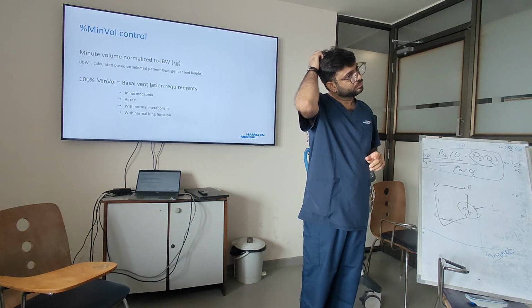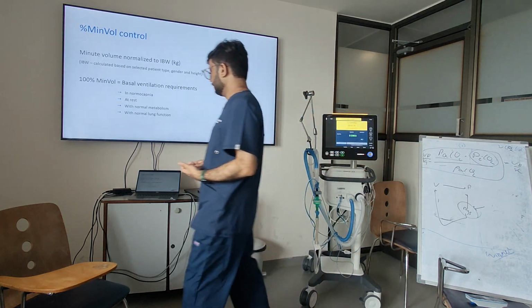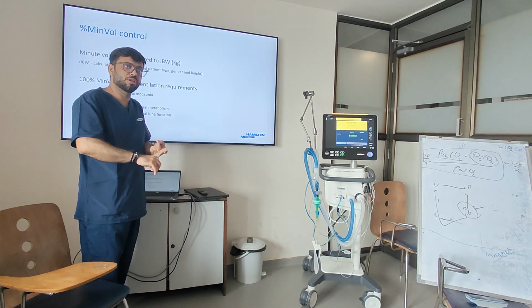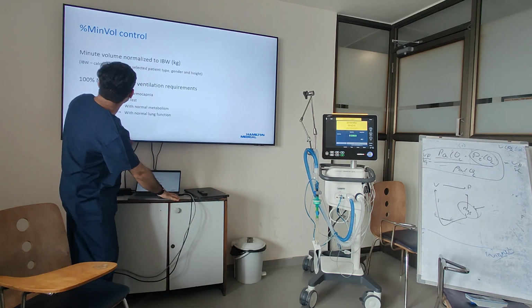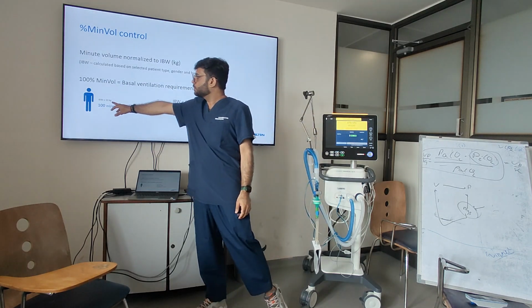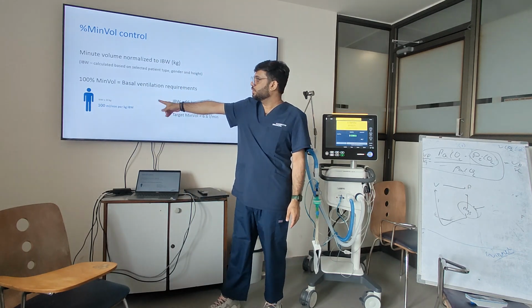In COPD patients, you may want to keep it high for enhancing more cycling. It's there in all modes basically, in all ventilators, especially in all the spontaneous modes, SIMV, spontaneous, you will get ETS. So as I said, ideally it is 100 ml per minute per kg of ideal body weight. For patients who are 30 kg or more, you are going to see this.